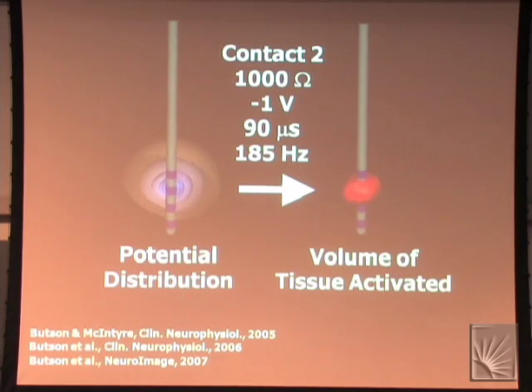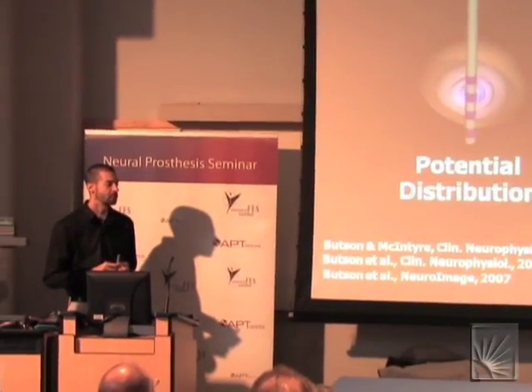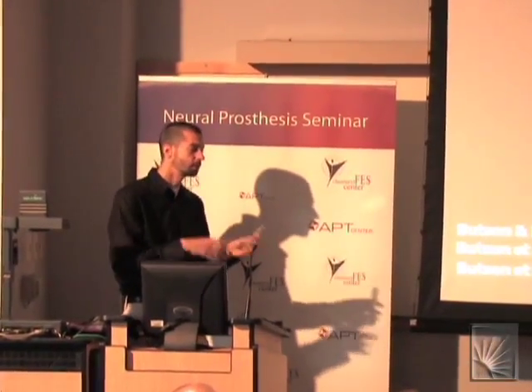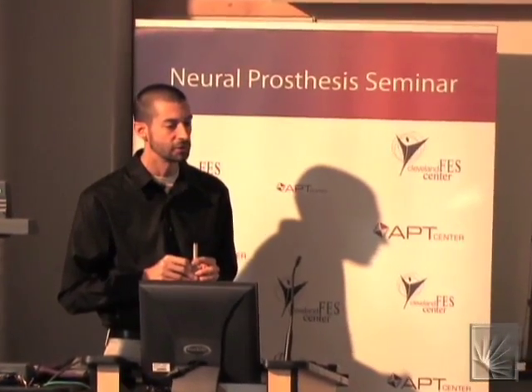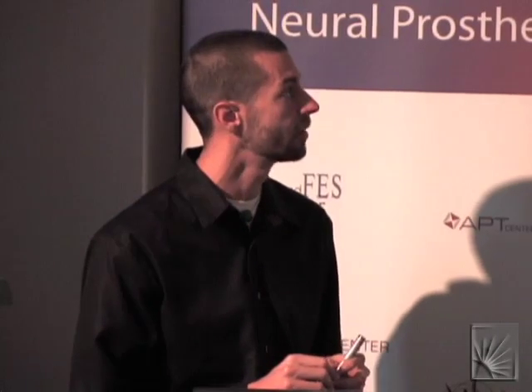The problem with that is that it's a very subjective process and really dependent on the experience of the clinical programmer in identifying either therapeutic benefits or side effects. And it's contaminated by the fact that stimulation is transient, and it takes time sometimes for some of the therapeutic effects to show themselves. It also takes some time for them to wear off. Same thing with some side effects. So we have lots of contaminating factors that corrupt this sort of parameter selection process.